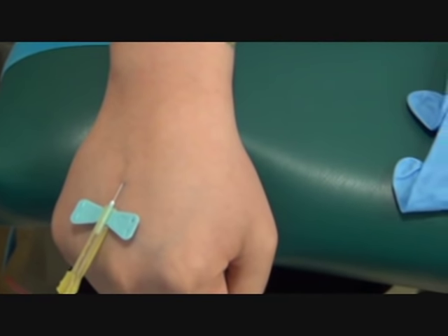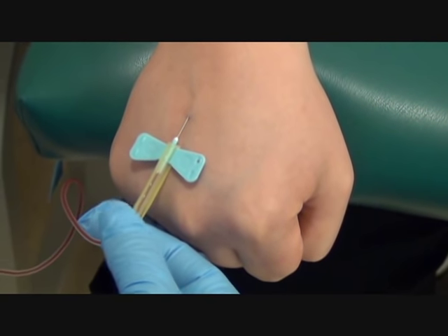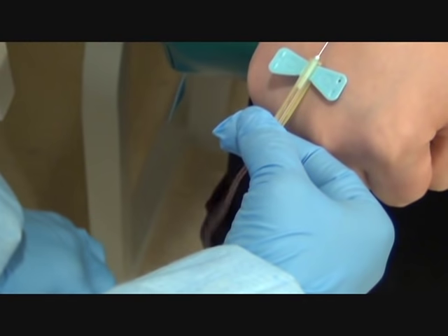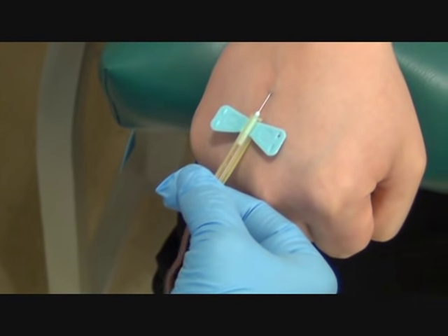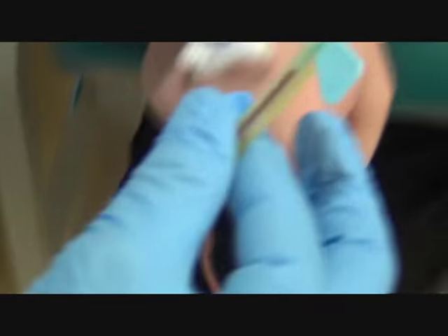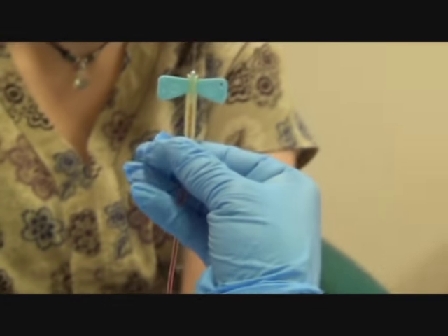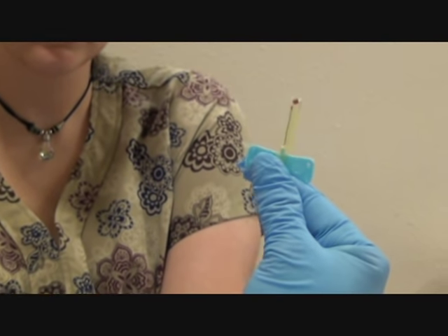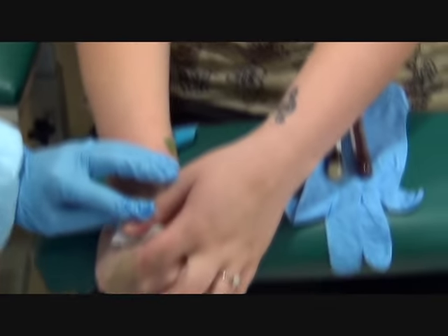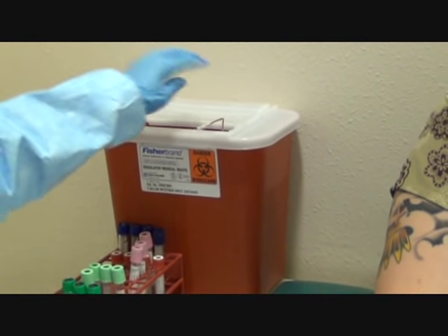Now I'm going to grab the base of this butterfly. I'm going to put down my hub. There's not enough space, so I have to just let it hang. And I'm going to pull out, apply pressure, and I want to wrap the tubing in my fingers. While I do that, I'm going to pull down and push up on the safety device, activating it. Please apply pressure. I'm going to discard the needle.